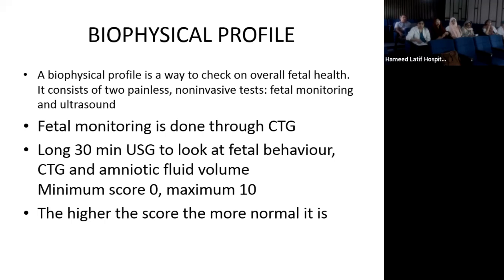Now come down. What will you do down below? Sir, pelvic examination. Sir, you told us to push the head back a little if cord compression is causing the decelerations. If you can do an ARM, I think you should do an ARM, but I don't know because it's a private hospital. Maybe they'll like it, maybe they won't. I don't know. Do they do an ARM? Yes, sir. Oh, thank God. Then do an ARM. Okay.